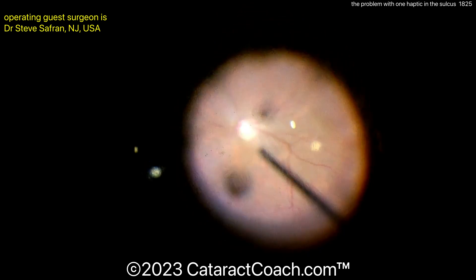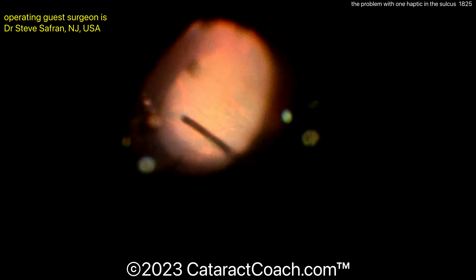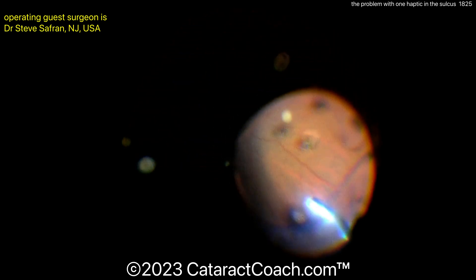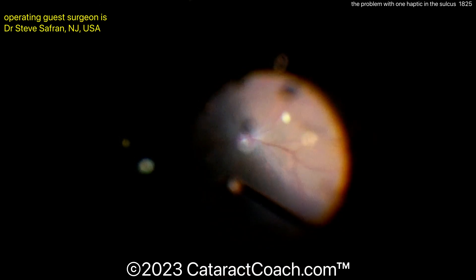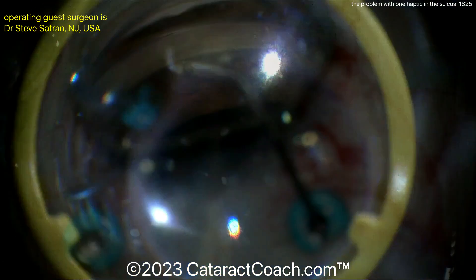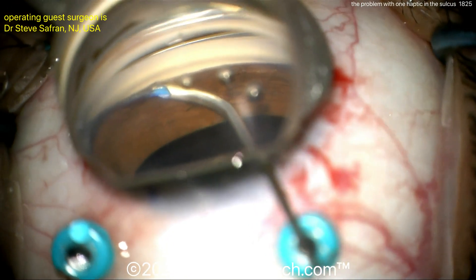This is a situation that I would refer to our vitreoretinal colleagues for, but that can all be cleaned up nicely. And make sure you check the retinal periphery as well. Make sure you check for entry-site breaks with your pars plana trocars where those are positioned.